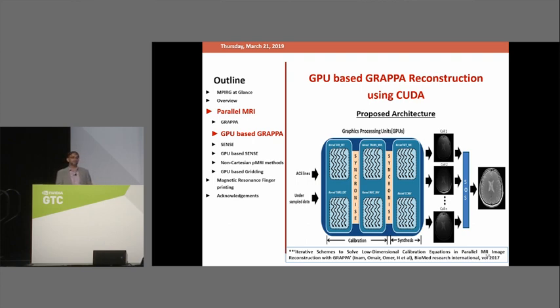We used CUDA kernels to do all those sequential operations in a parallel fashion, which will ultimately reduce the image reconstruction time significantly. Then we have the individually reconstructed multiple receiver coils, and at the end we perform sum of squares reconstruction to get a composite image.